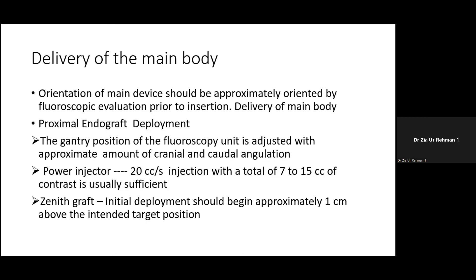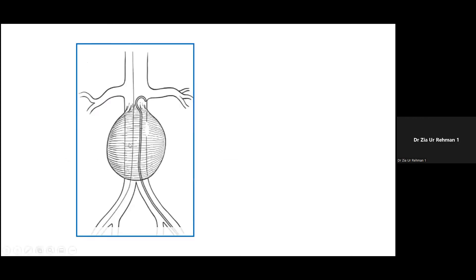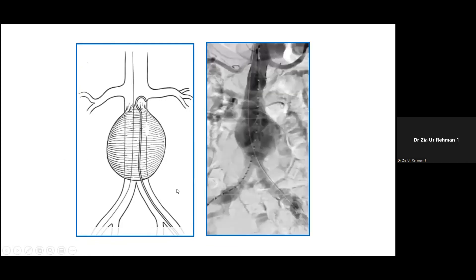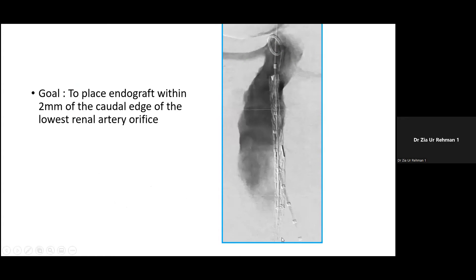It is good to use a pigtail catheter with radio-opaque markers. As shown in this angiogram done with the power injector, the super stiff guide wire and the pigtail catheter are visible along with the anatomy. The pigtail catheter is at the L1-L2 level; the left renal artery is typically the lower one shown here, and the right renal artery is above it. The main body is positioned accordingly.